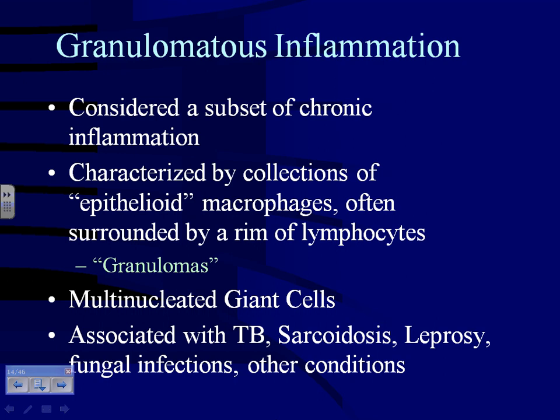You may have some multinucleated giant cells in the background, but remember, these are rather nonspecific cells by themselves, because you can see multinucleated giant cells in a number of things. They are a type of macrophage, obviously, just different than the epithelioid ones. They're multinucleated. The nuclei tend to be rounder and darker.